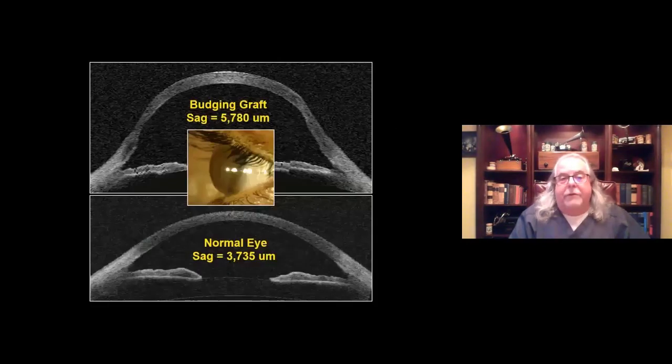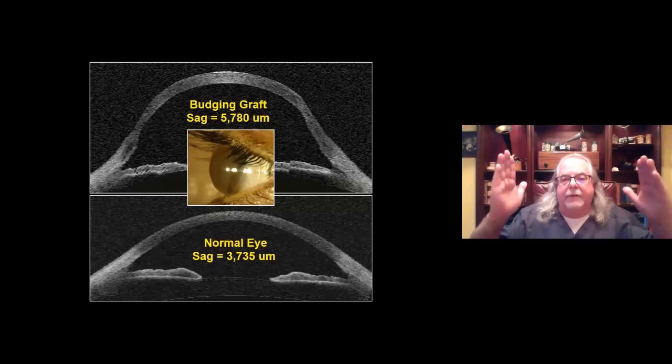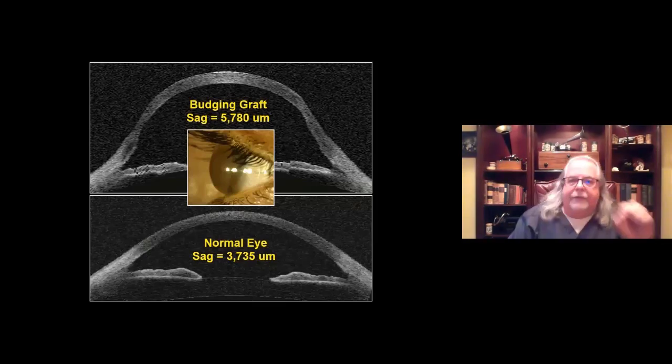Now, where you're going to be jettisoning both the limbal clearance and peripheral corneal clearance is in these individuals. These are individuals that have enormous sagittal depths. And you can see here that we're going to need a contact lens with a very steep limbal zone, a very steep peripheral corneal clearance zone to create the desired clearance in the lens.